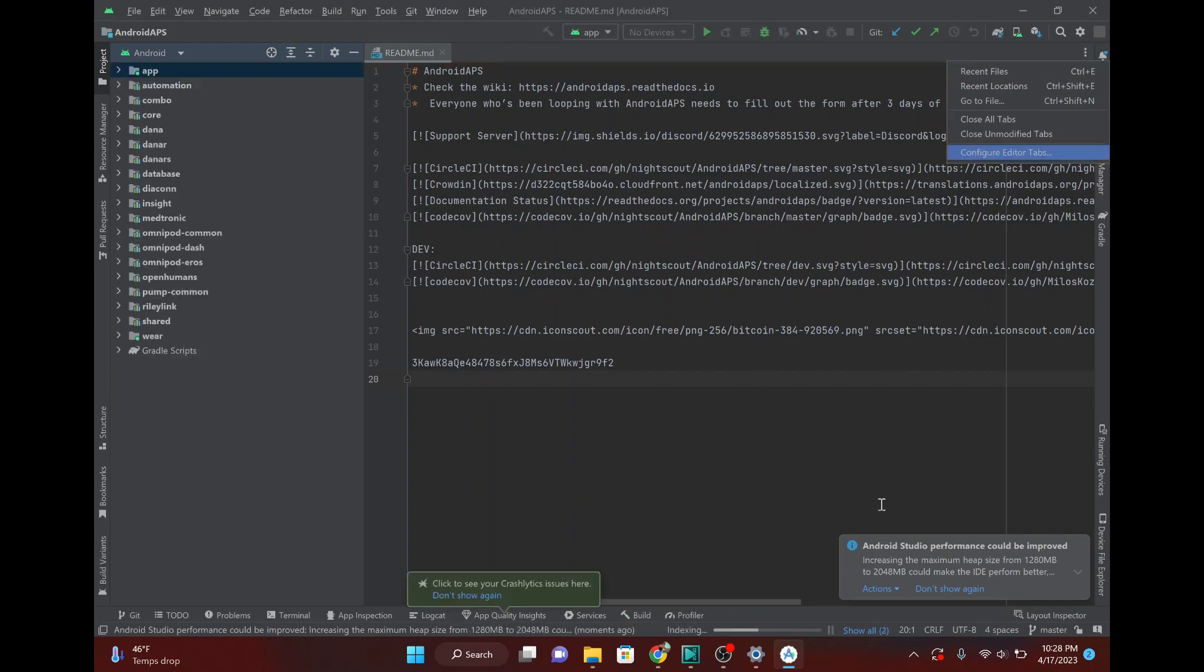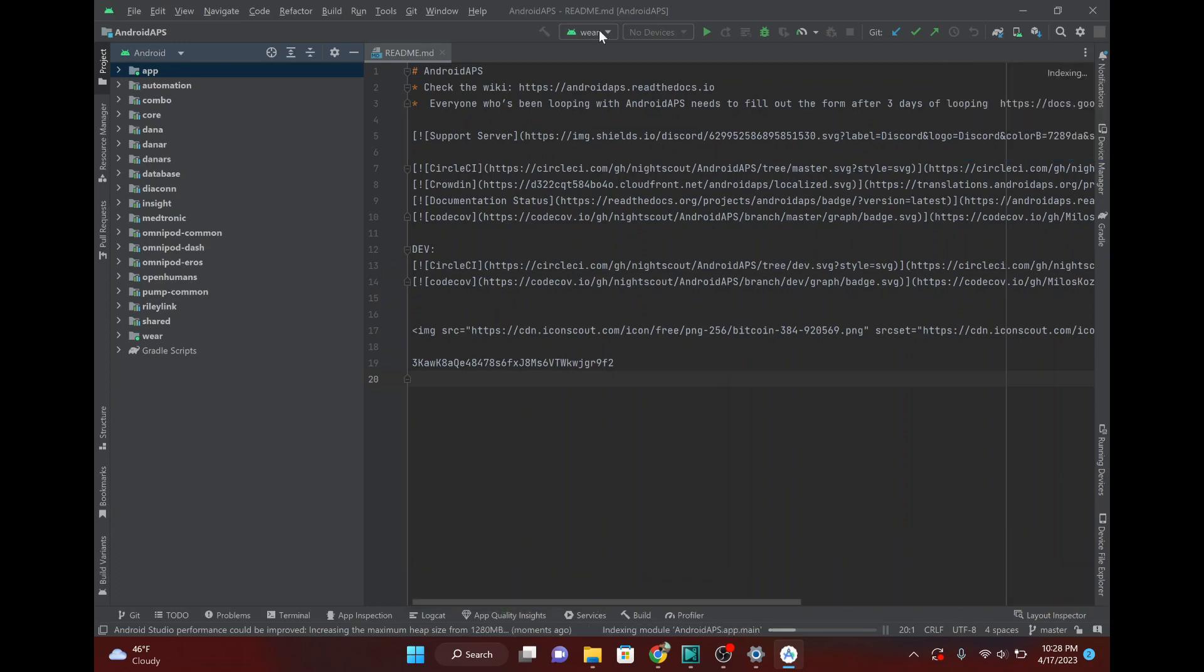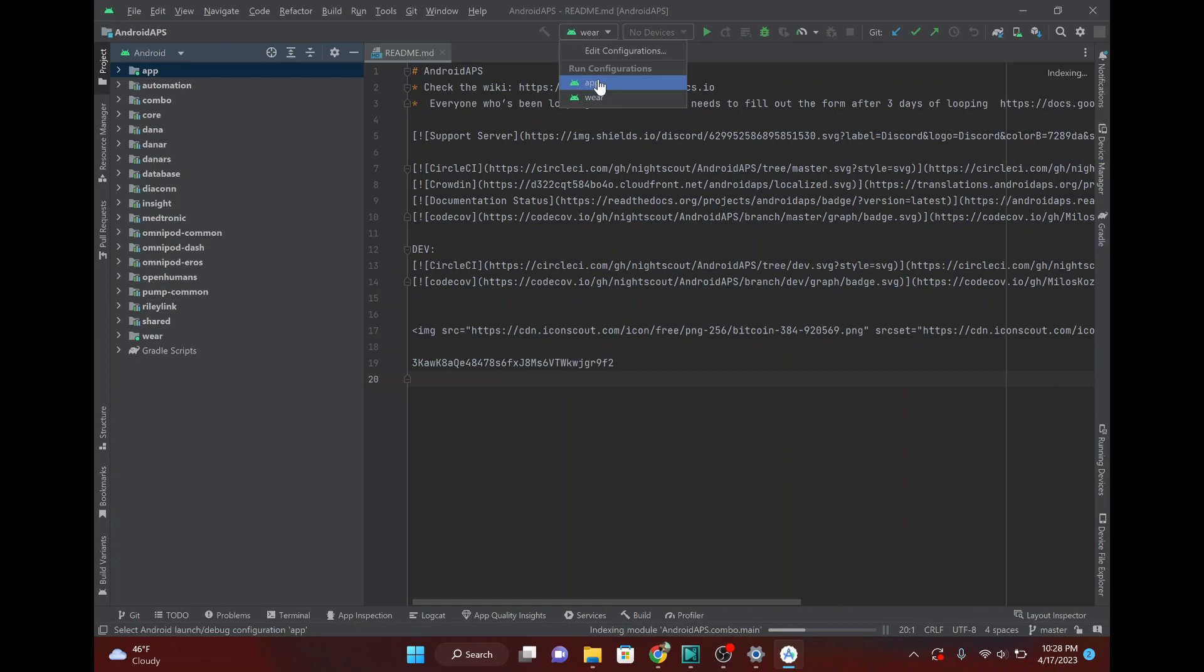All right, you might see this message pop up. Do not, any message that you see about having to update Gradle or improve performance or anything like that. Just ignore it. It can cause some problems. Looks like we're all finished and all the code and everything's downloaded. So, go ahead and you want to go to the main app.